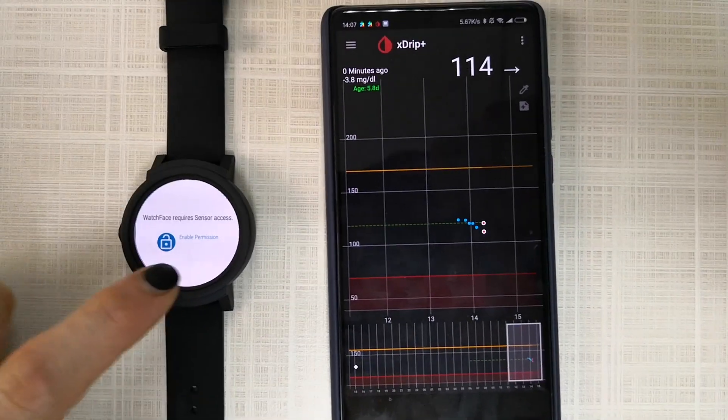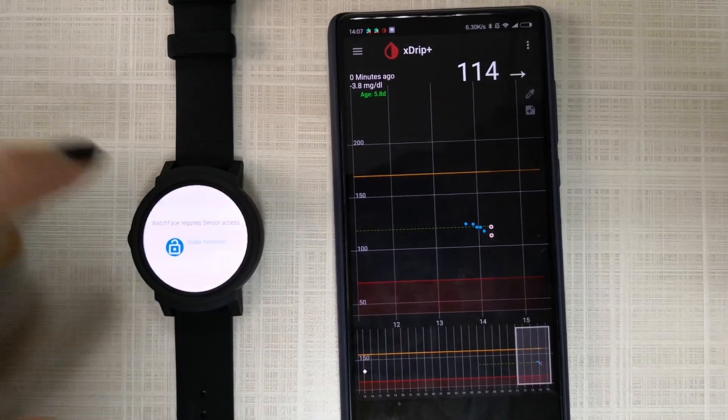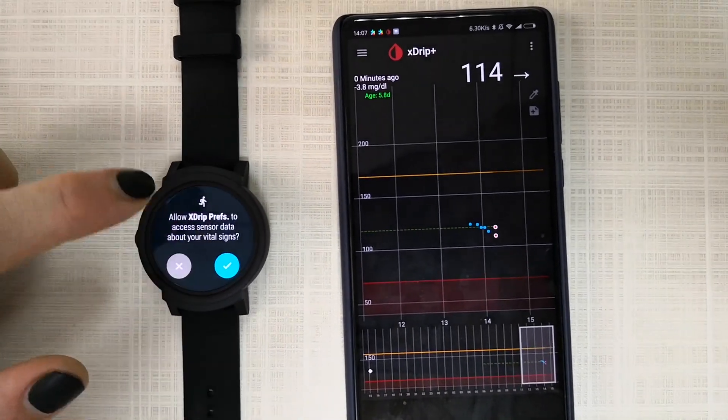After calibrating your watch, you want to enable the watch face on your watch.